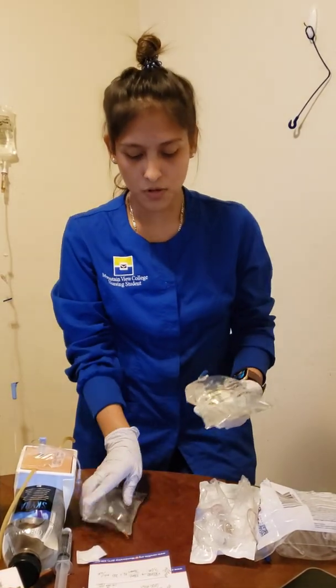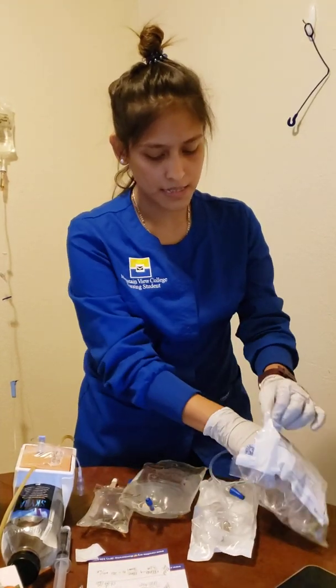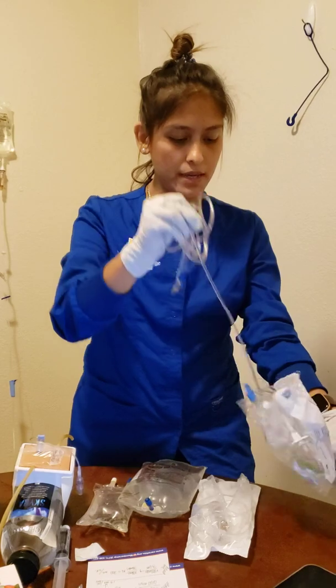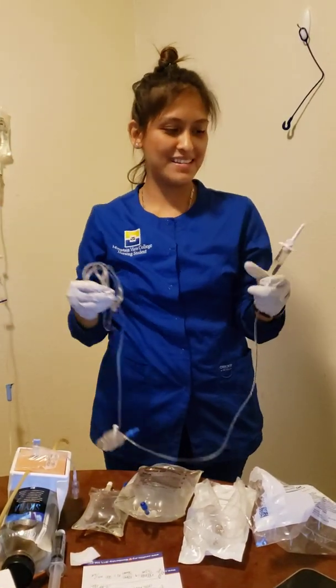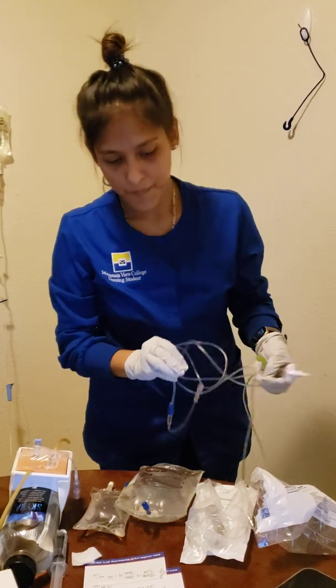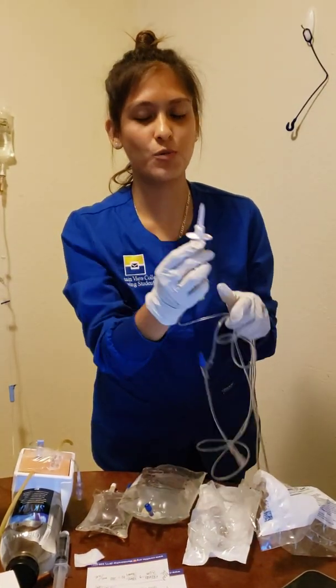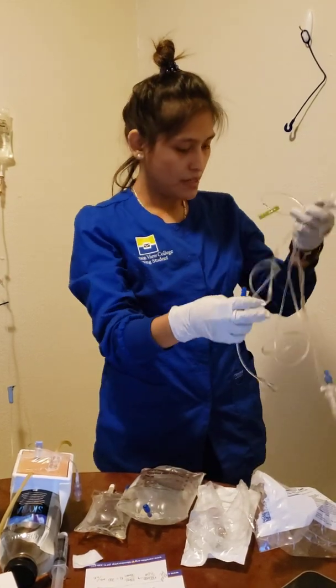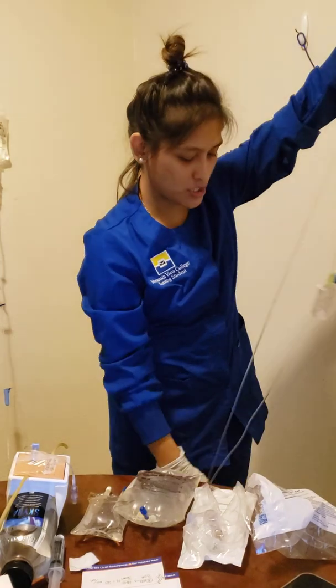So I'm going to go ahead and prime this. And again, like I said, this is all brand new tubing, has never been used. I want to be very careful with it and keep sterility. I lost my top to this, so we're going to pretend that it has a top. I have all of this, making sure that it doesn't touch the ground.